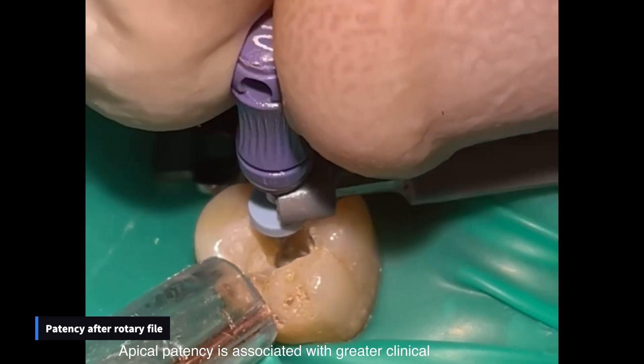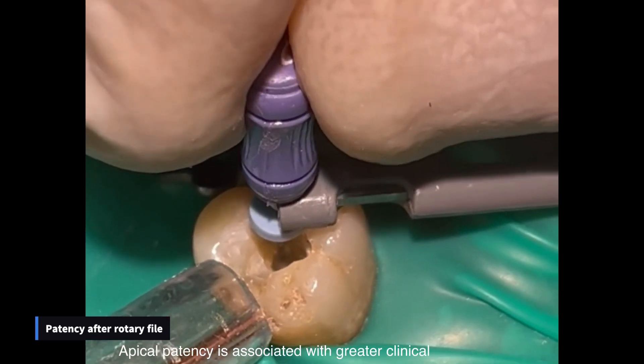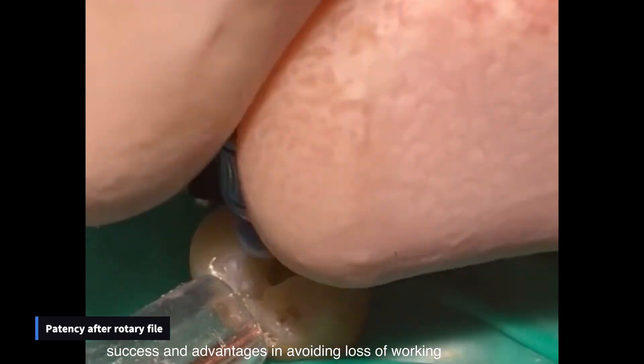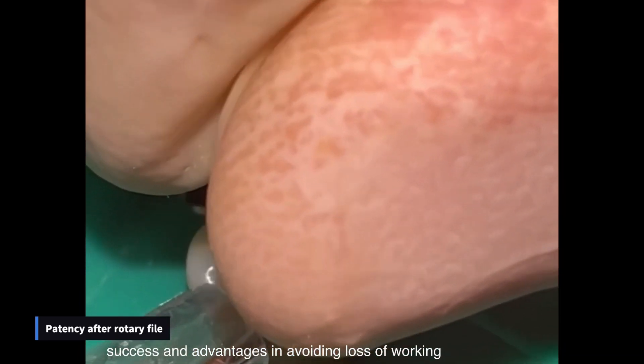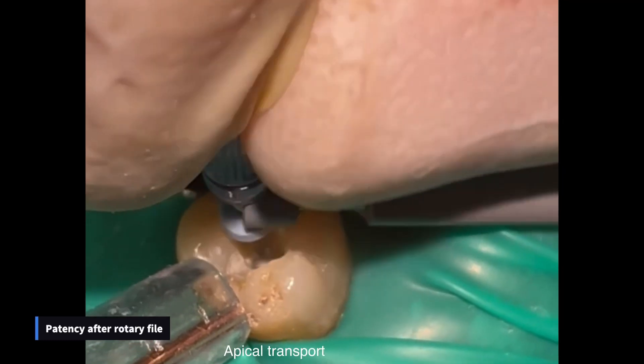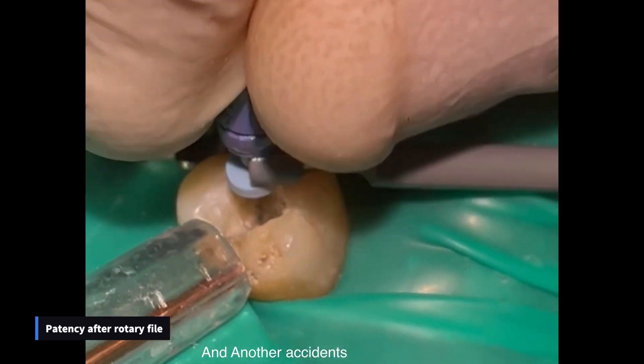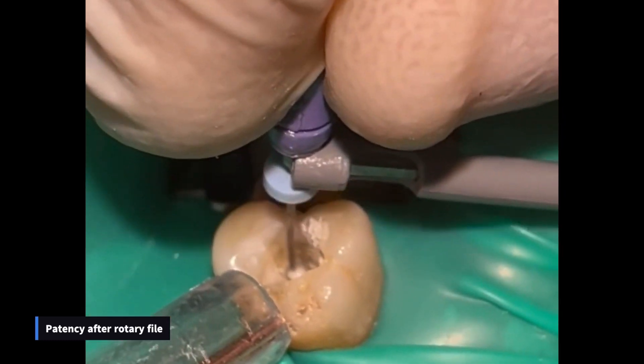Apical patency is associated with greater clinical success and advantages in avoiding loss of working length, apical transport, and other accidents.